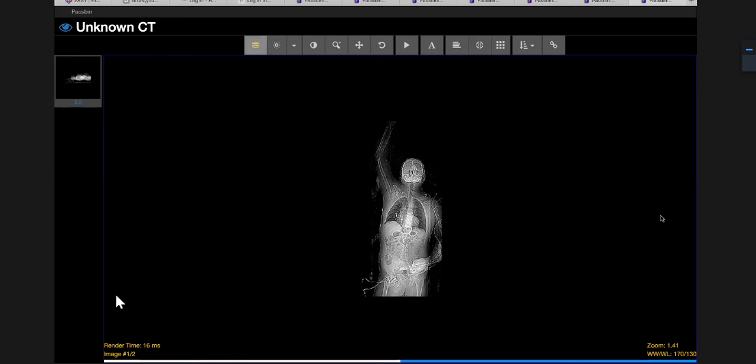This way it saves time and saves radiation, because otherwise you have to scan them twice. It gives you an overview of any injuries. The only problem is if you see a vascular injury or contrast blush, how do you know if it's arterial or venous? Sometimes you don't, so you end up doing the delayed phase anyway.